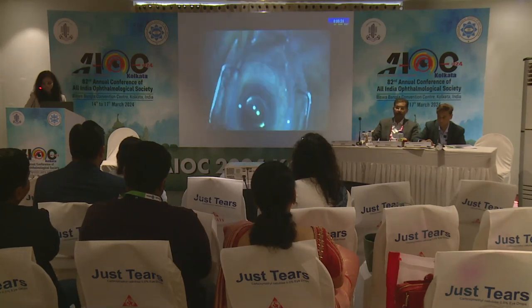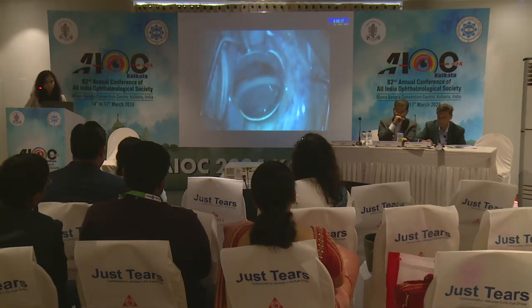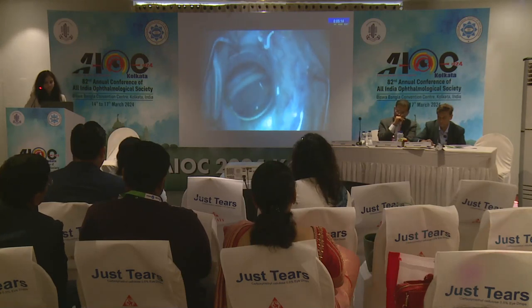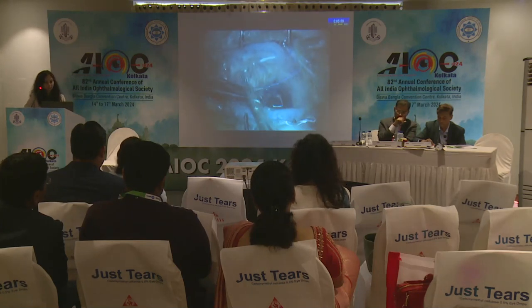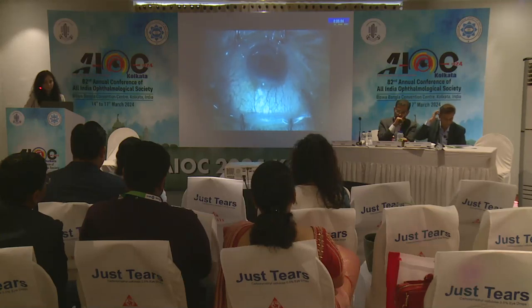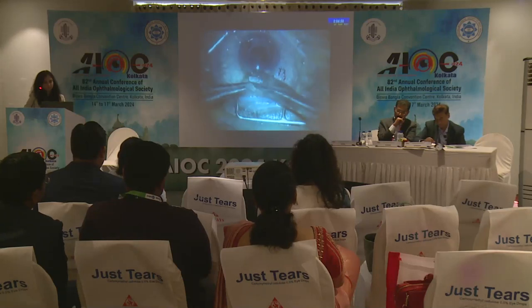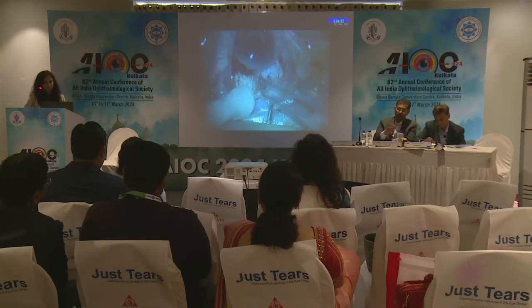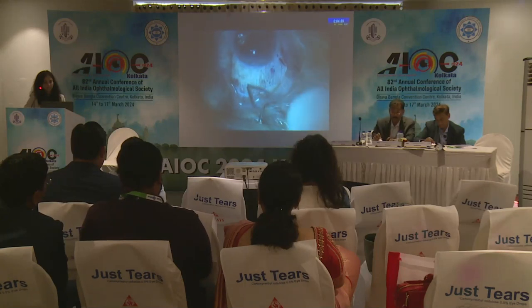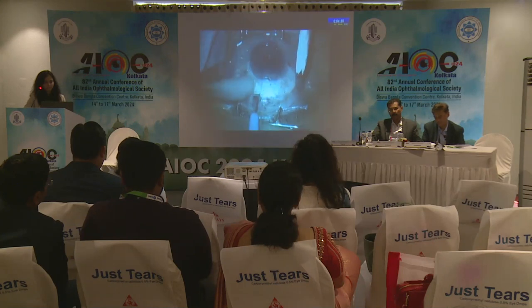This is a surgical video of a patient who had hypotony for 6 months post-injury with a cricket ball. Intraoperative gonioscopy is done to localize the extent and the number of clefts. Corneal traction suture is applied to provide adequate exposure. Localized conjunctival peritomy is done in the area of the cleft with the help of Westcott scissors. Hemostasis is achieved with the help of wet field cautery. A side port is made and viscoelastic is injected in the anterior chamber with a 30 gauge cannula.